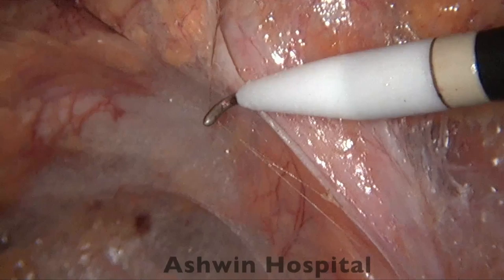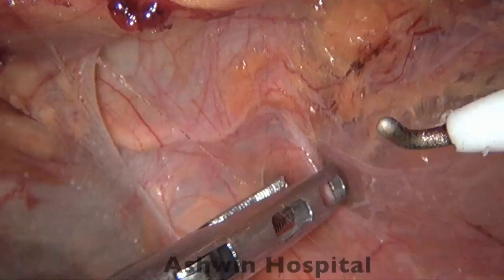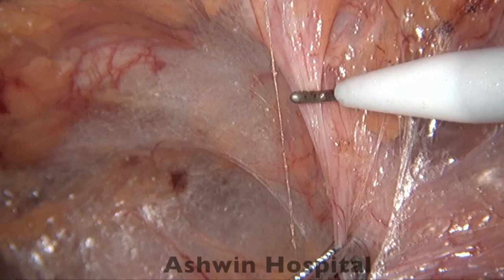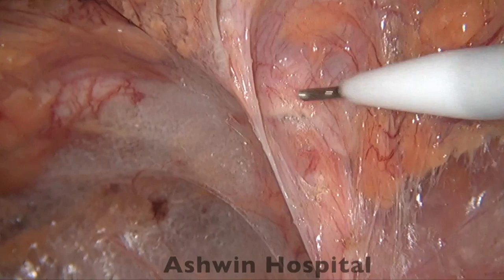So now you can see that whitish structure, which is the pseudosac, and we can do a nice precise dissection. You don't really need cautery over here, it's just your preference. If you're comfortable, you can use some cautery. Otherwise, just using some instrument and pushing off the pseudosac is also good enough, and that works well. We will show you that technique also in another video shortly, a little later in the presentation.